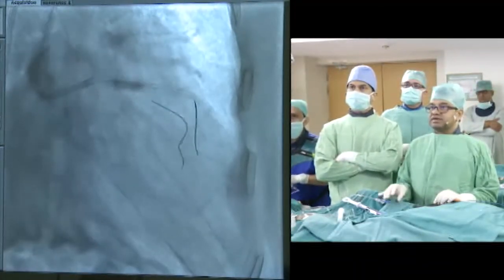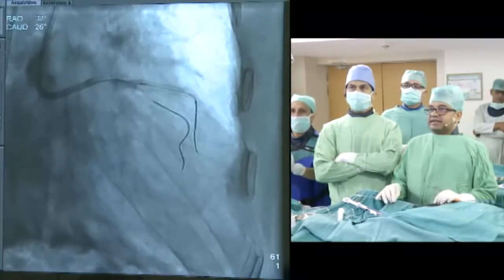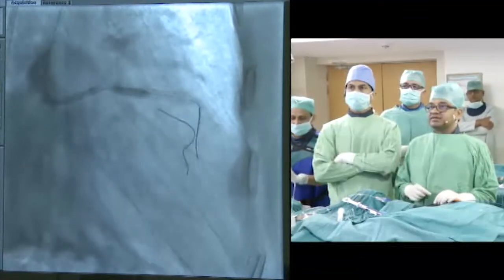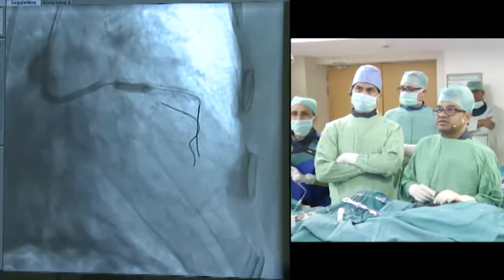Okay, so your team will take an OCT run also. Looks like a nice expansion there. Thank you. So go up again, 18, 20. Again. So that looks to be expanded now. We'll keep it for 30 seconds there.